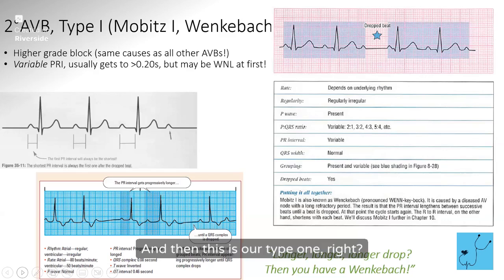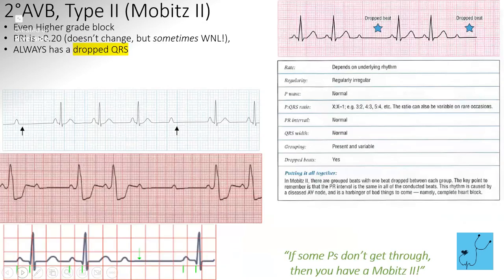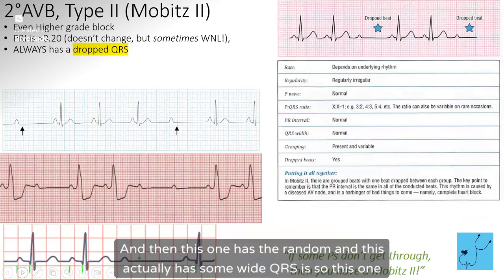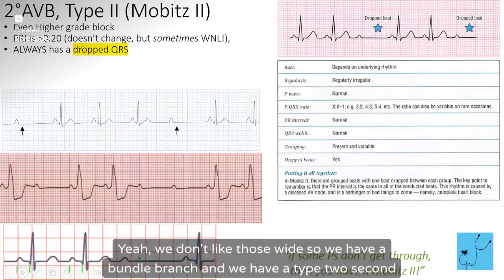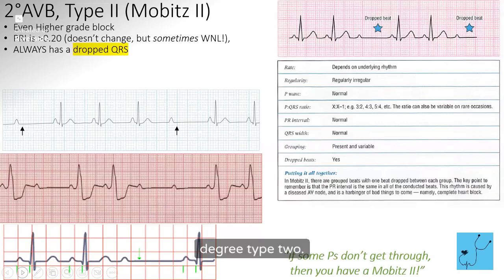And then this is our type 1, right? Our dropped beat, Wenckebach. And then this one has the random, and this actually has some wide QRSs. So this one, they're already having some ugliness, right? Yeah, we don't like those wide. So we have a bundle branch and we have a type 2, second degree type 2. So we've got some stuff going on there.